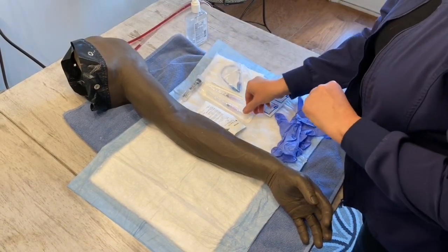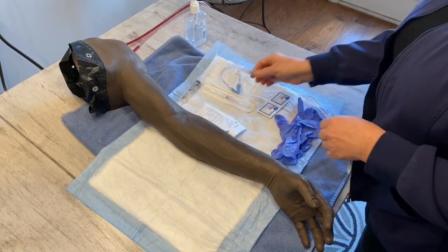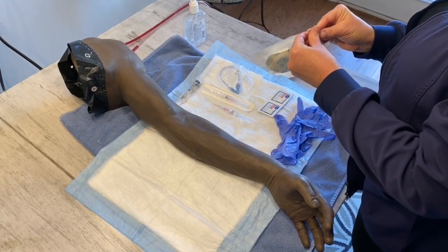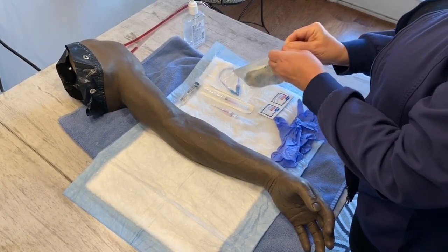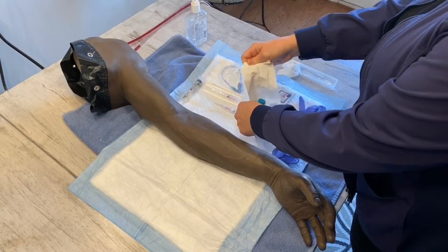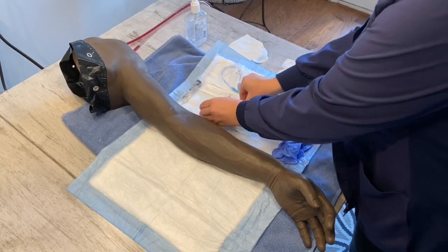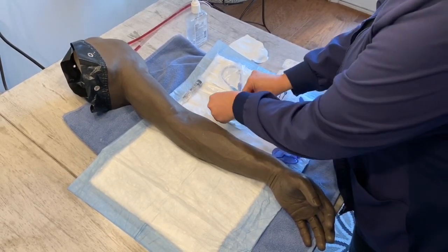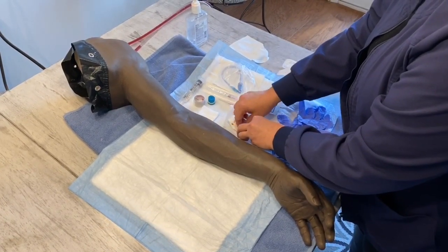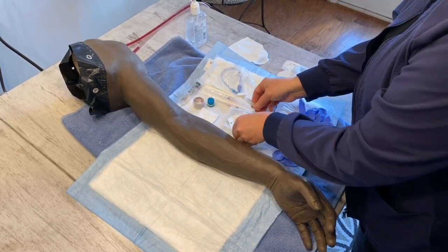So I have my IV flush, I have my IV catheter. I'm going to go ahead and open it up. I have my IV kit. And in my kit, I have actually my tourniquet, gauze, tape, and my antiseptic that I will be using. I like to get everything out and prepared so that it makes it a very easy flow and insertion. Normally, you're by yourself when you do this.